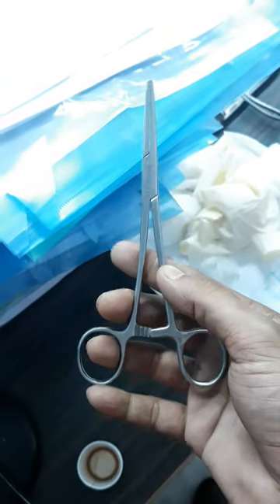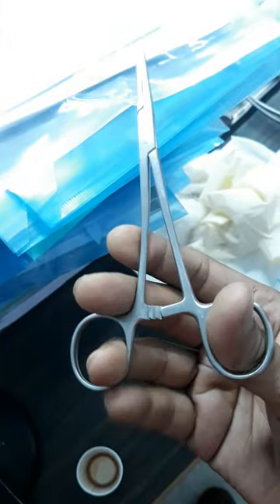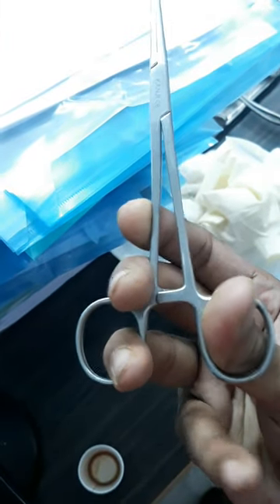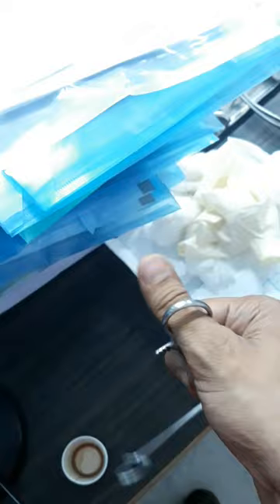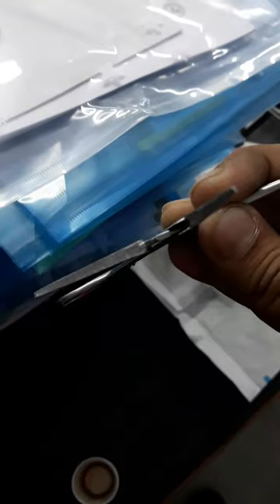This instrument is basically a Spencer Wells Haemostatic Forceps. There are two types: a medium-sized curved as well as straight. This is a straight Spencer Wells Haemostatic Forceps. It has a ratchet, a pair of shafts, and a pair of blades. The blades are usually half the length of the shaft.